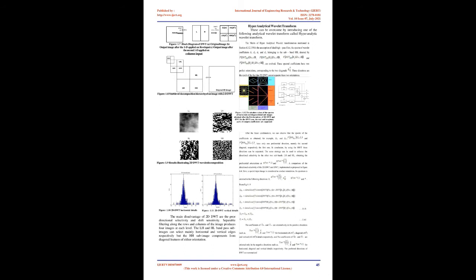The main advantage of the classical bilateral filtering method is that it considers both the spatial locality and neighboring points with similar amplitudes at the same time, which makes it better at preserving the image edges and textures than the conventional linear filtering algorithms. We propose the adaptive hybrid bilateral filter that smooths the pictures while conserving the edges, and suggests a nonlinear combination of close image values.